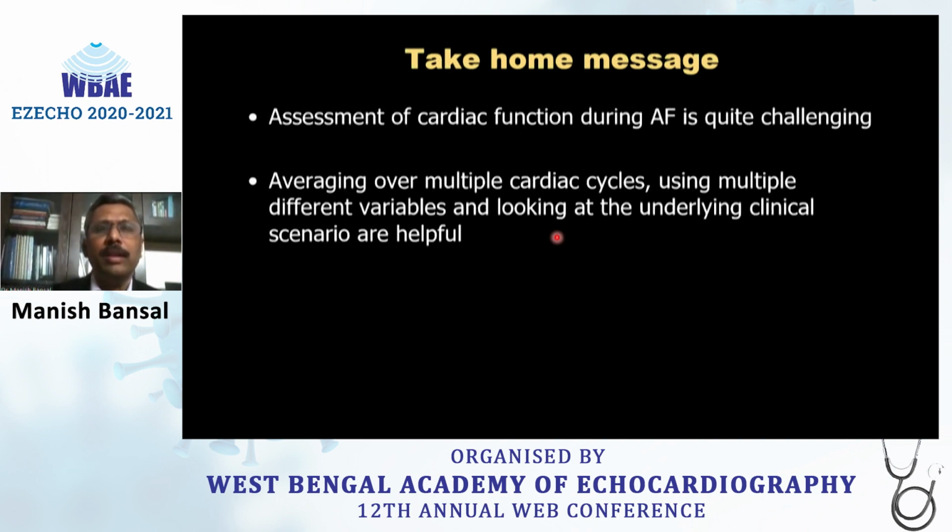So to summarize, assessment of cardiac function during AF is quite challenging. Averaging over multiple cardiac cycles, using multiple different variables, and looking at the underlying clinical scenario are helpful in reaching a reasonable conclusion.